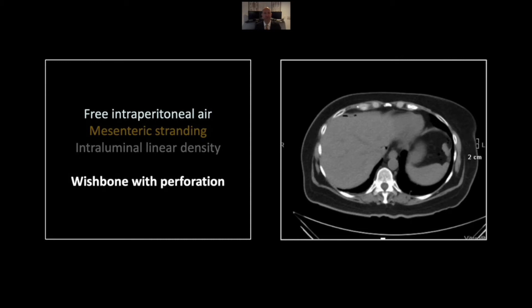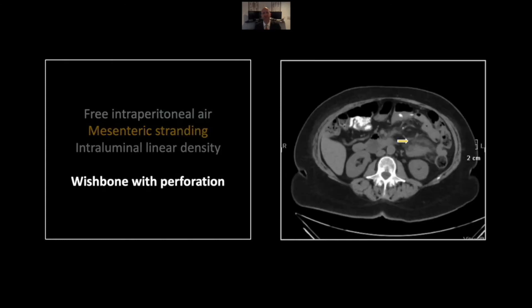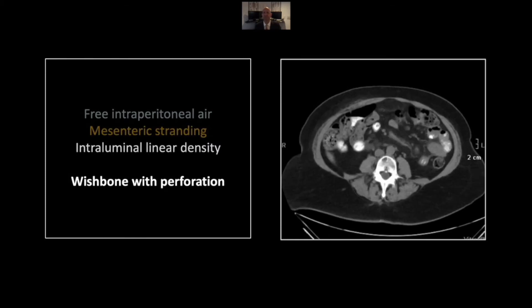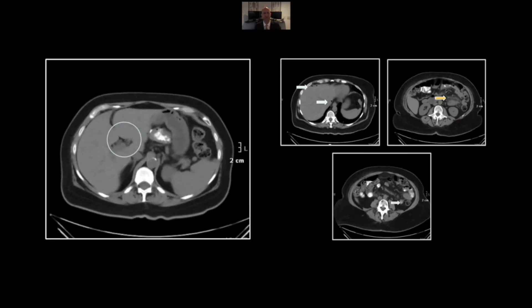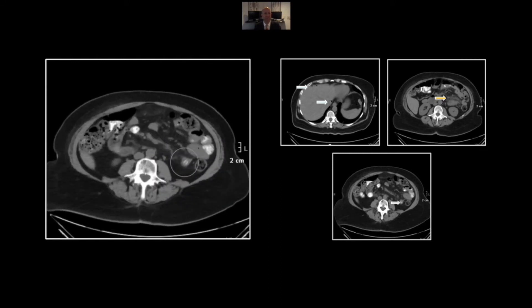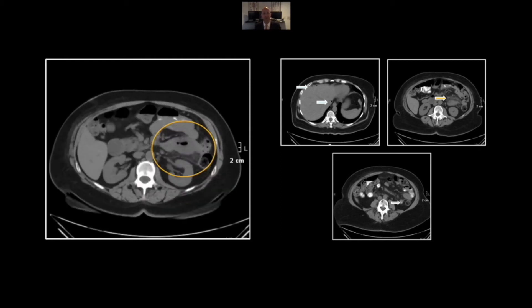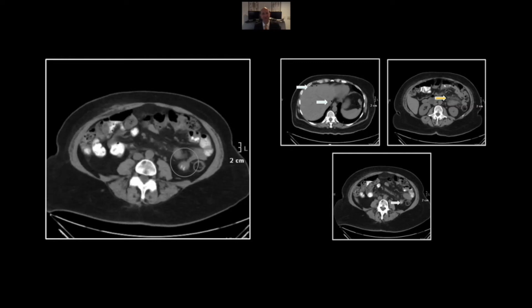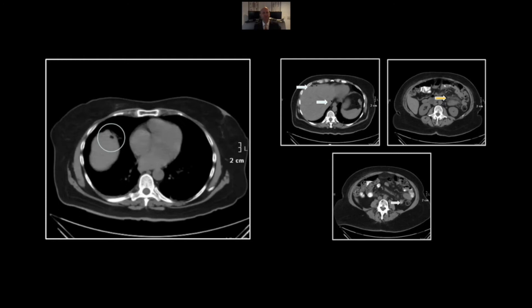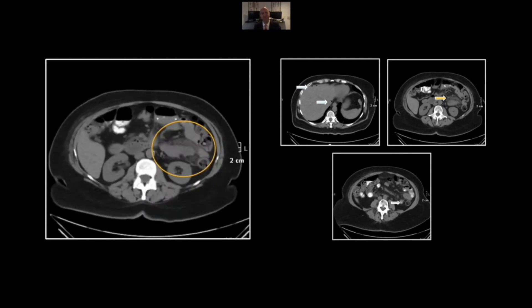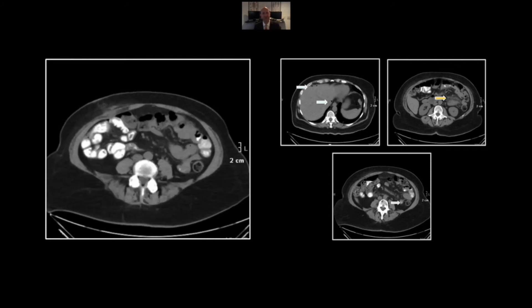Our next case is an ingested wishbone with bowel perforation. See small foci of free intraperitoneal gas in multiple locations. Stranding throughout the mesentery. And here, two prongs of a calcified density within the lumen of the small bowel — that will turn out to be two limbs of a wishbone. Of course, ingestion of an entire wishbone is suggestive of another problem, that being alcohol ingestion, although of course it was the holidays. I also learned from our teaching file the actual nomenclature for a wishbone, and that is a furcula. So that is a turkey furcula causing a small bowel perforation.